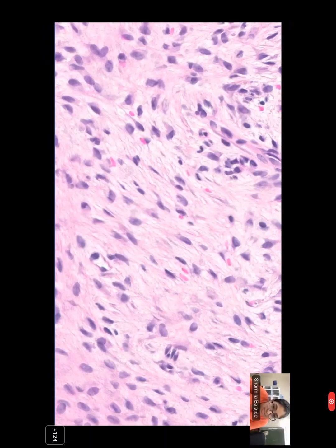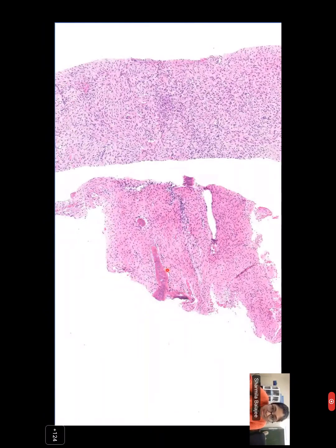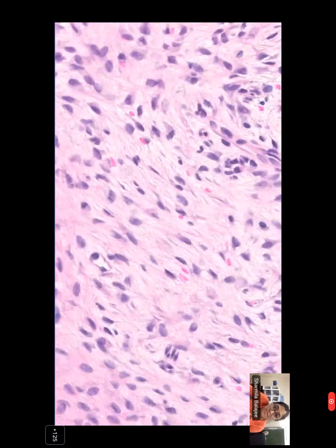Yes, sir. And also there is some new osteogenesis. Okay, next let's go to the next stage, which I'll take. So here's the bone formation. Inside that bone, there are these osteocytes. So new osteogenesis with osteoblastic rimming was there, I felt, sir.